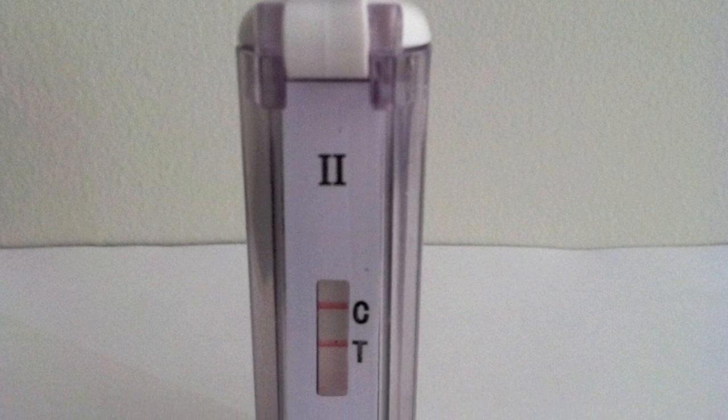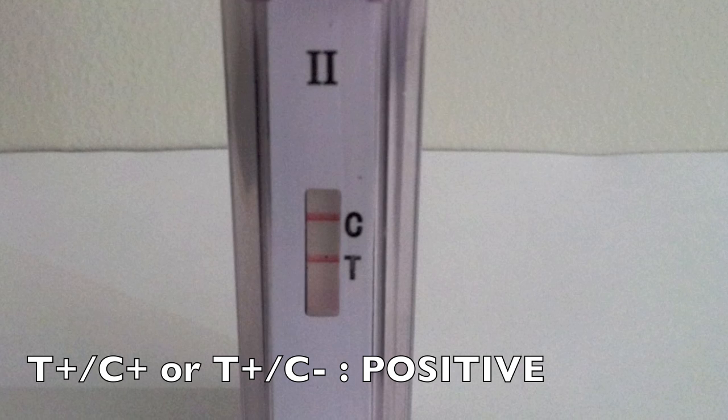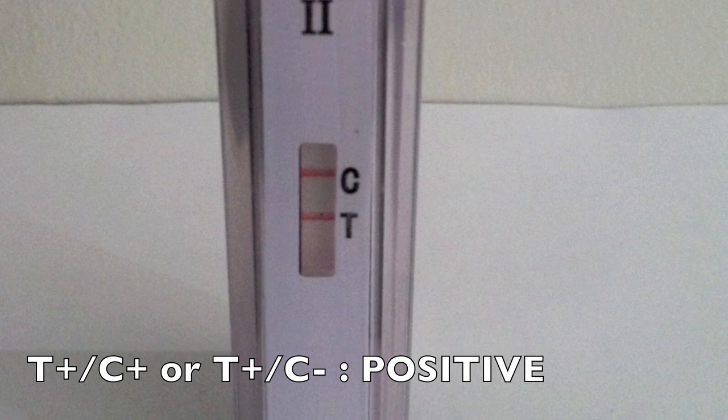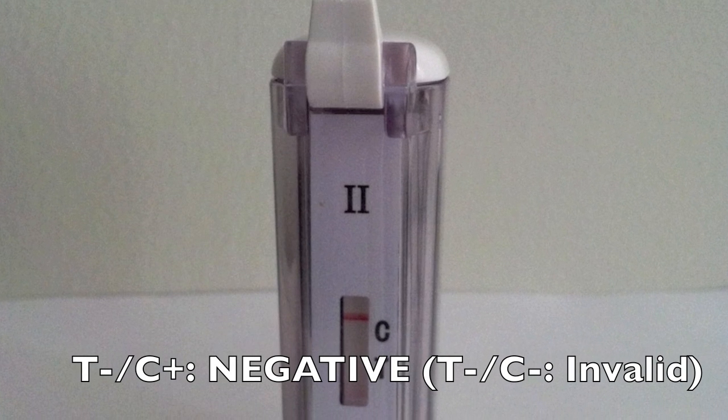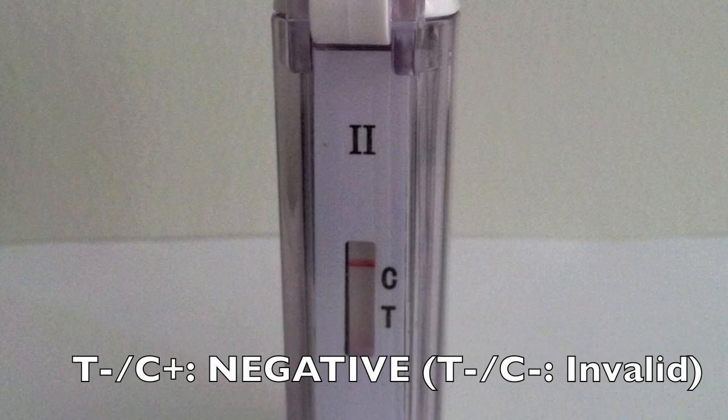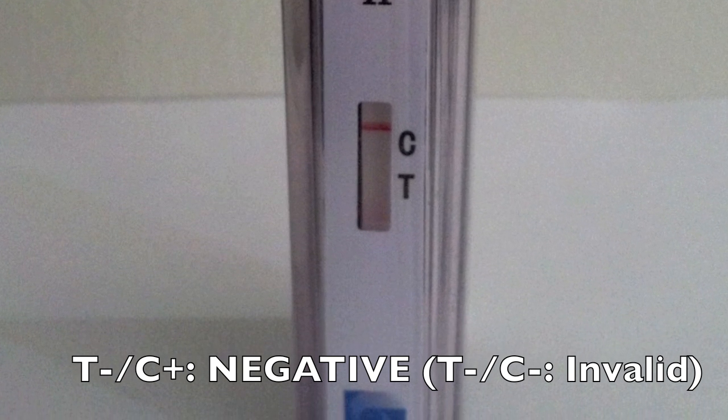Always read the test or T-line first. When a T-line is visible, report the assay result as HSV DNA detected or positive. When no visible T-line is present and a visible C-line eliminates the possibility of a false negative, the test result is negative.